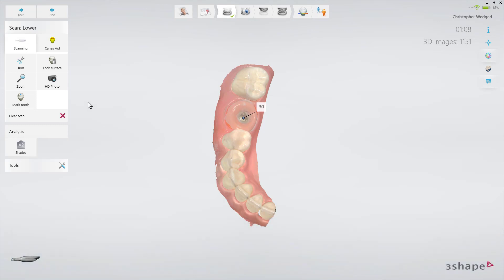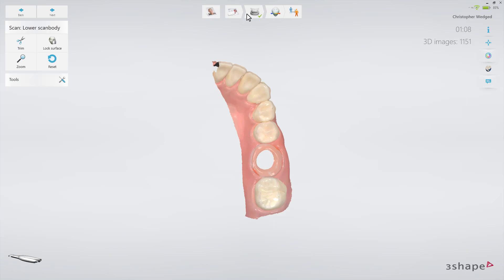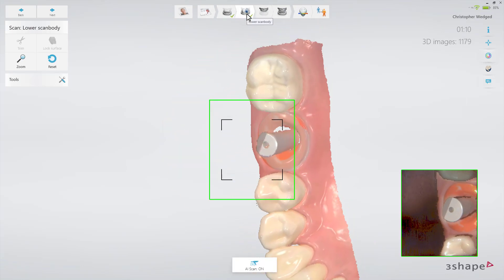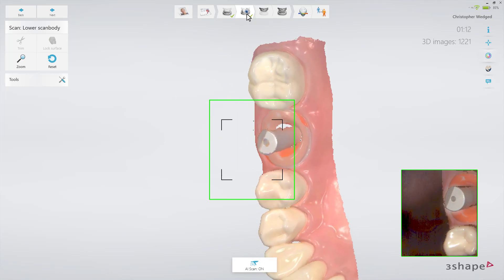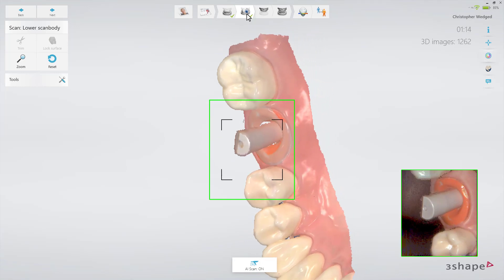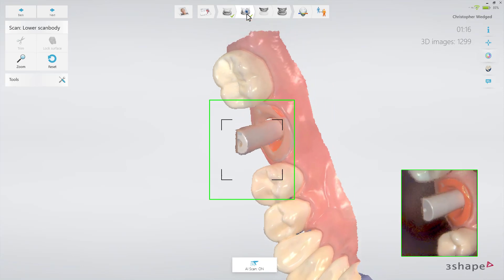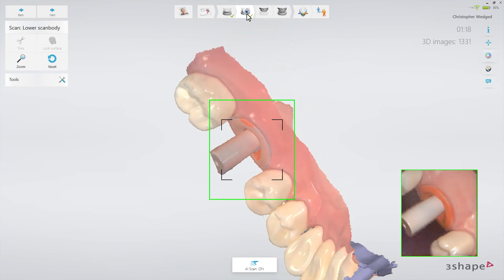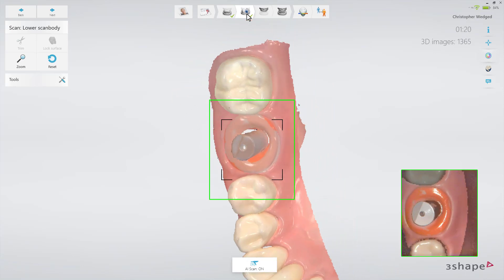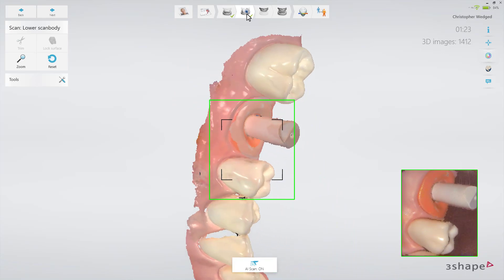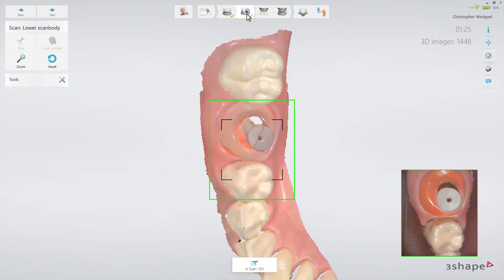Make sure that all of the implant has been trimmed away, as well as the nearby surroundings. Insert the Scan Body and proceed to the Scan Body page in the top workflow bar. Start the scanner pointing at a neighboring tooth. Once the scanner has picked up the position, slowly move to the Scan Body and circle around it to scan it from all angles. It is especially important to cover the upper third of the Scan Body to make it possible for the laboratory to recognize the correct position.